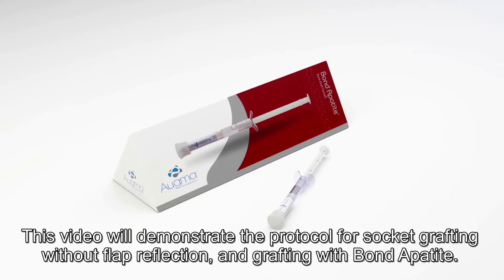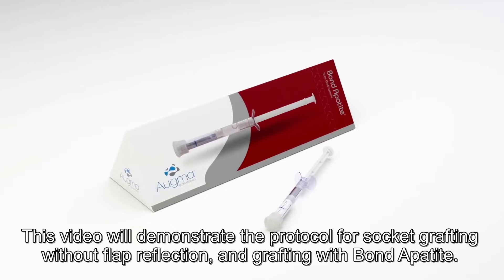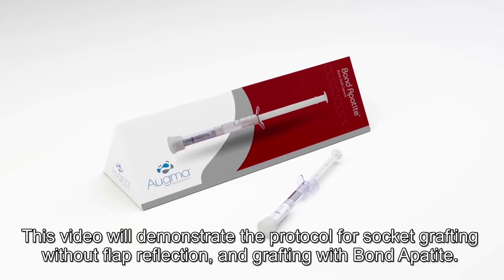This video will demonstrate the protocol for socket grafting without flap reflection and grafting with Bond Apatite.